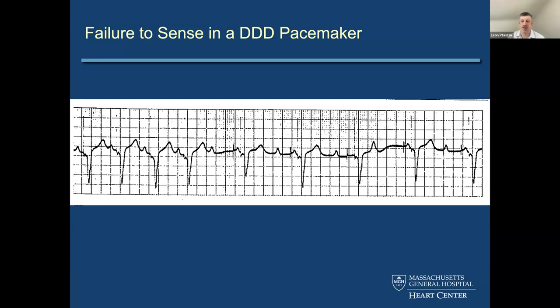I hope that clarifies it. But every now and again, something funky will happen, and just know that for the future, you may not have a perfect explanation for what's happening on every beat every time. But certainly we're seeing a lot of evidence here as you go across the tracing of inappropriate sensing.